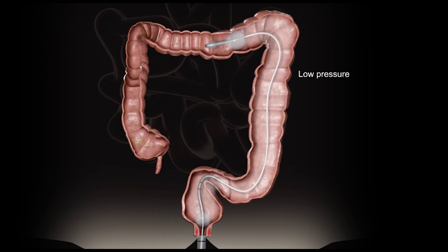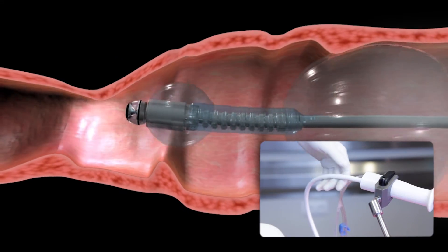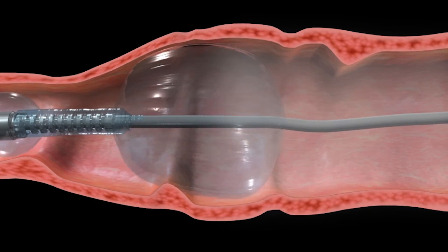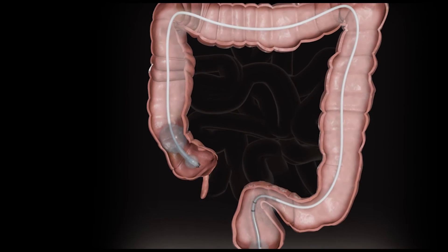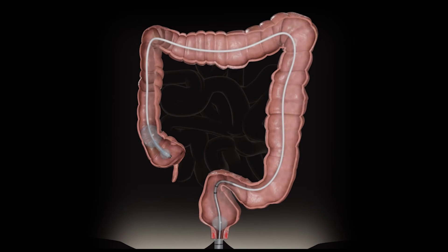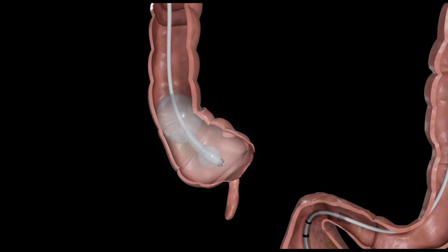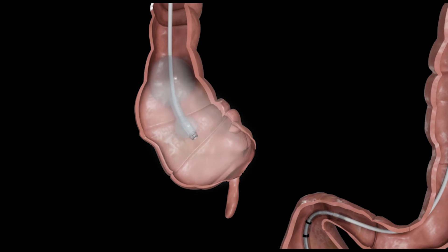As the balloons are gently pushed through the colon by the operator, and with aid of the CO2 pressure, their diameter and shape are constantly adjusted to suit colonic anatomy. When the Aeroscope Disposable Scanner reaches the cecum, CO2 between the rectal balloon and scanner balloons is vented through the rectum. The space between the cecum and the scanner balloons is then inflated with CO2, and the pressure levels gently push the scanner balloons backwards.